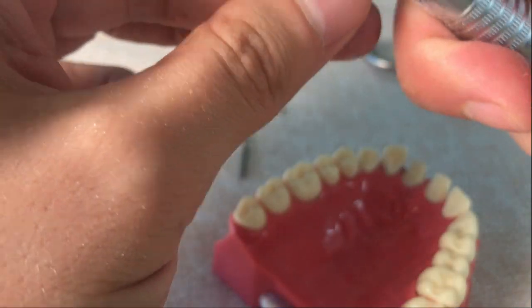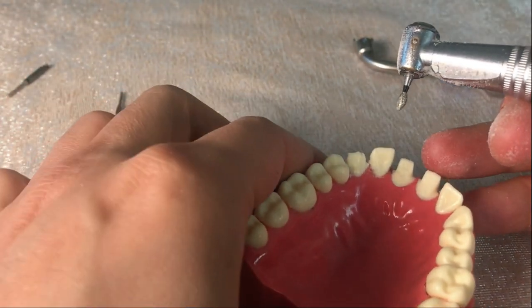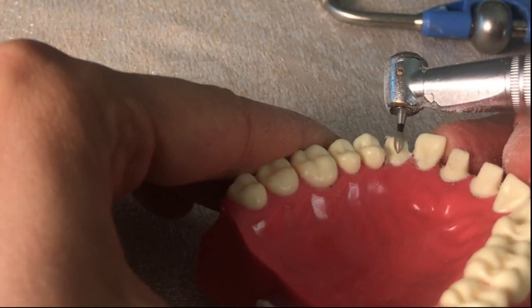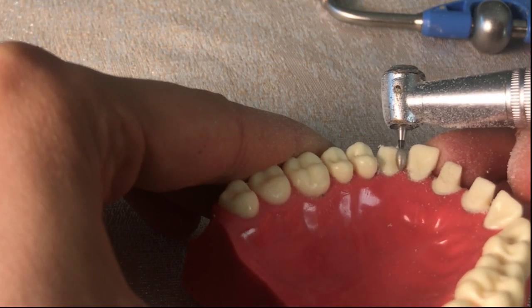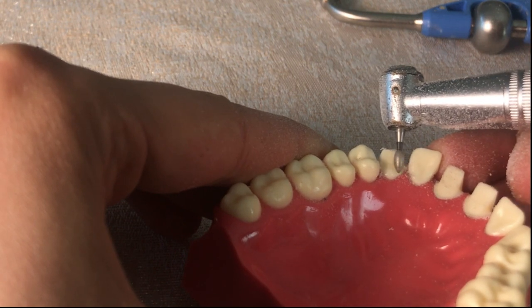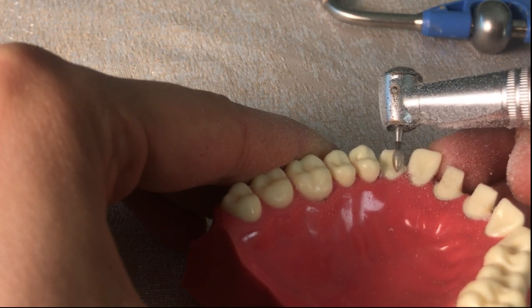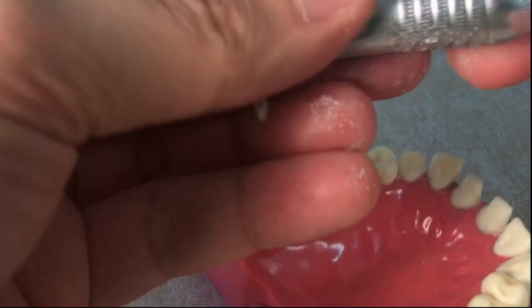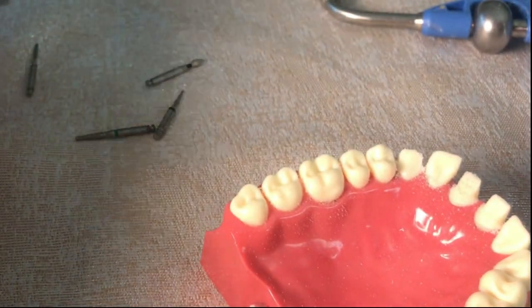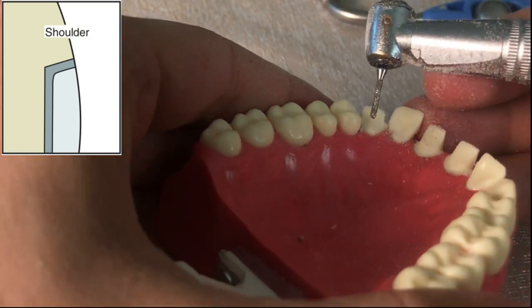I insert the pear-shaped burr for the preparation of the palatinal. I make the reduction on the upper part of the cingulum with this burr. Then we continue with the shoulder burr to form the step on the palatinal side.